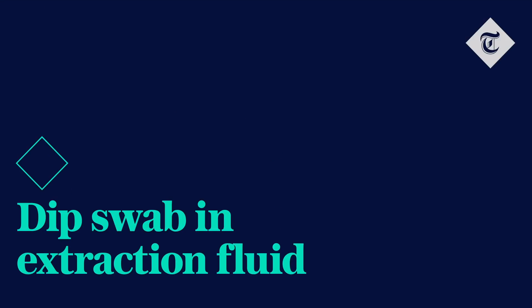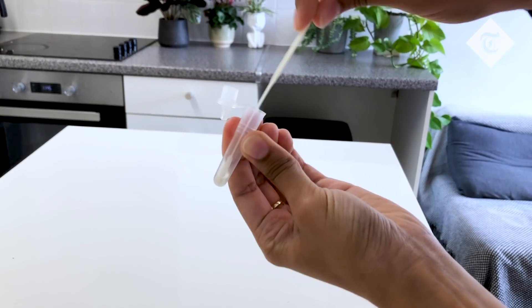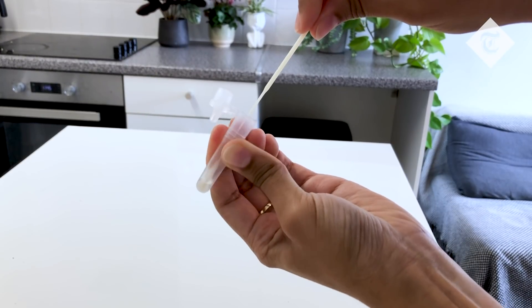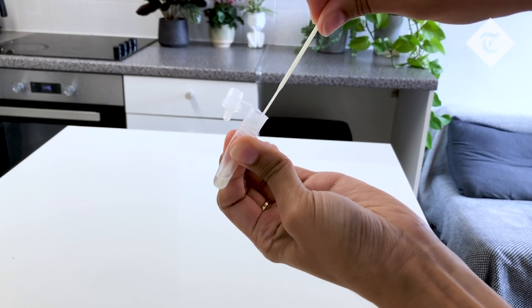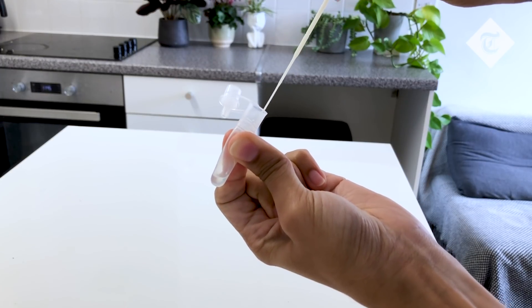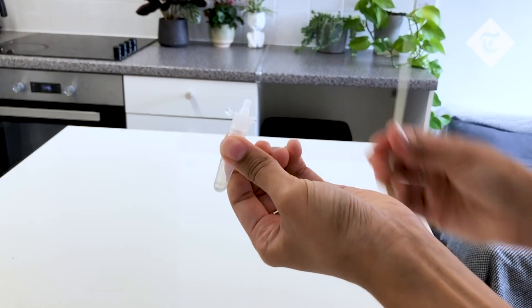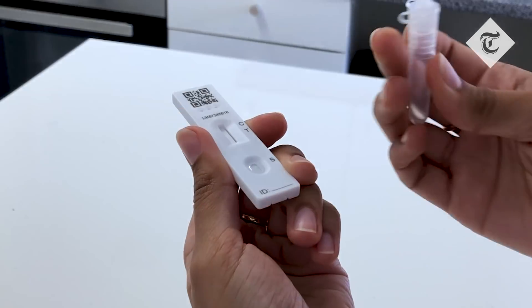Next, dip the swab into the extraction solution. Swirl the swab around thoroughly for 10 seconds, and when you pull the swab out pinch the sides of the tube together to extract all the fluid that might still be on the swab. Using the dropper end of the tube, drip this solution onto the paper pad and wait 30 minutes for the result.